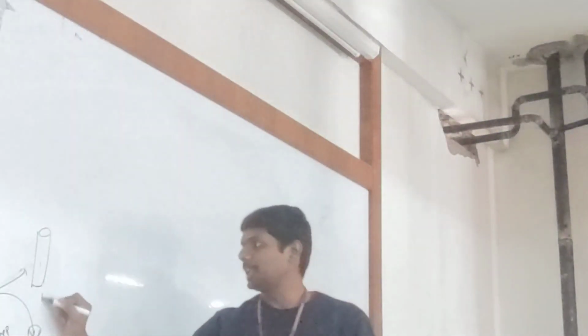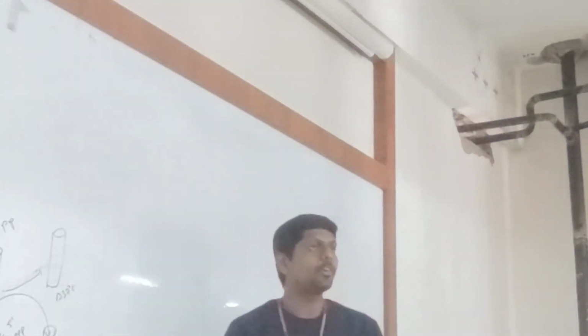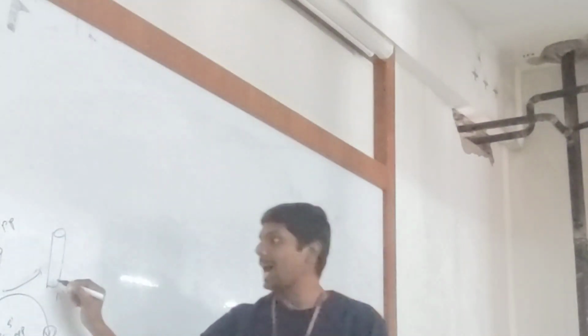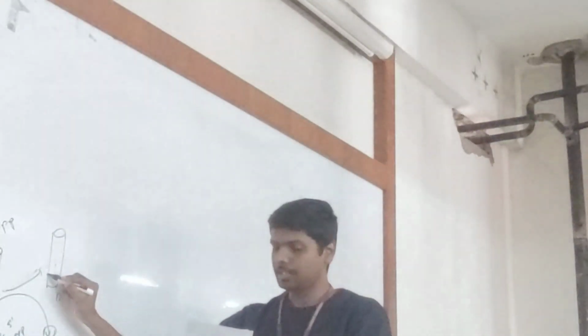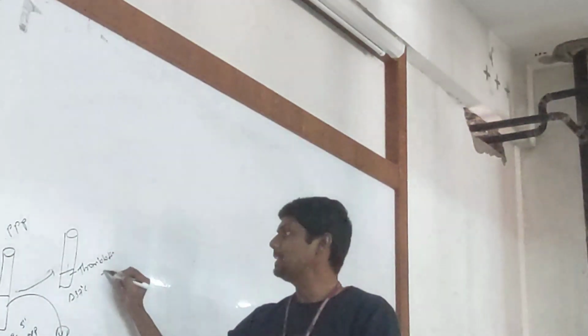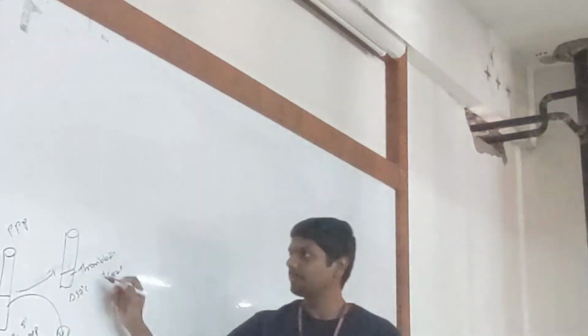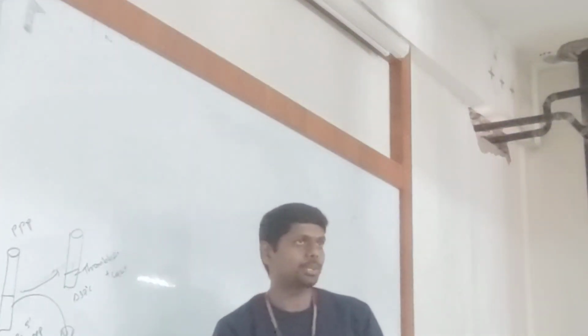Okay. Pre-warm the test tube at 37 degrees centigrade. In this test tube, add the reagents. What are the reagents? Thromboplastin plus calcium. You added the reagents, thromboplastin plus calcium. Okay. How much thromboplastin and calcium?